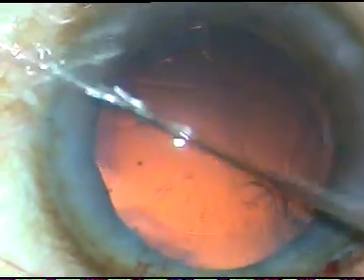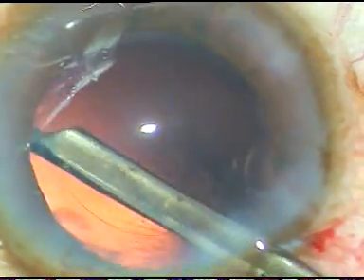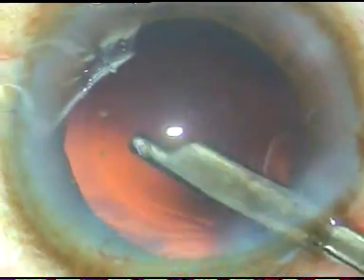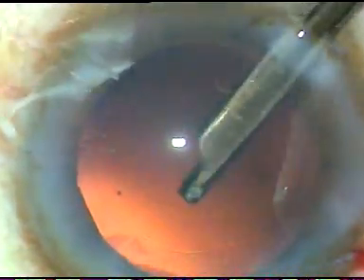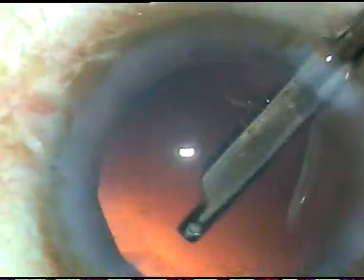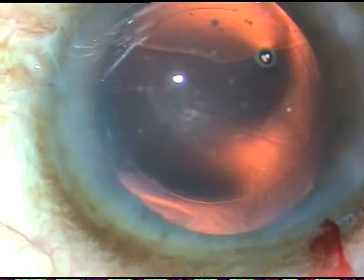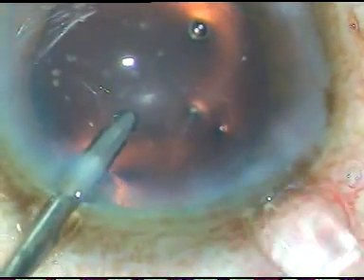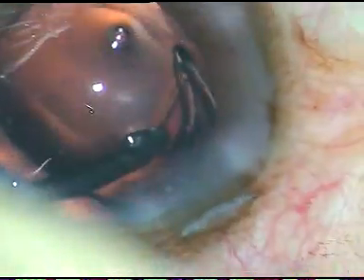In this case, the cortical cleanup has been done by this time. And once the cortical cleanup is done, a foldable intraocular lens is implanted in the capsular bag. Yes, a foldable intraocular lens, because the Indian foldable lens has become really economic and we can use them for free cataract surgeries. Some of the intraocular lenses are available for only 200 rupees, that is less than $3. So each poor patient undergoing free cataract surgery deserves a foldable intraocular lens for those for whom we are doing phacoemulsification.